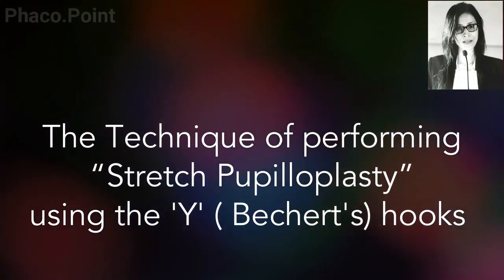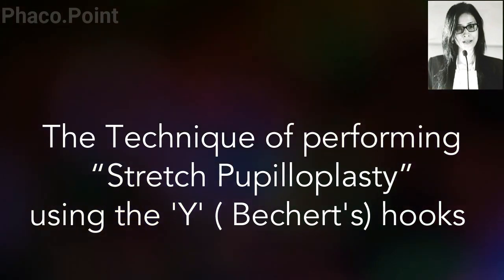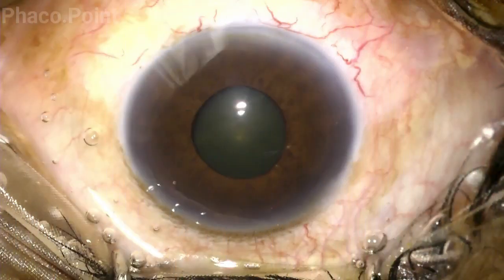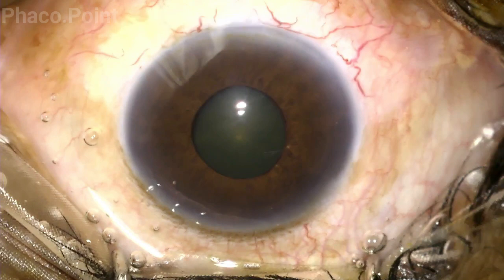In this video, we will demonstrate the technique of performing a stretch pupilloplasty with the help of Y-shaped hooks. This patient with an advanced immature cataract is to undergo phacoemulsification surgery. The maximum pupillary diameter as you can see is no more than 4 mm. Let's see how we proceeded with this case, where we were able to achieve a significant and satisfactory pupillary dilatation using two Y-shaped hooks.